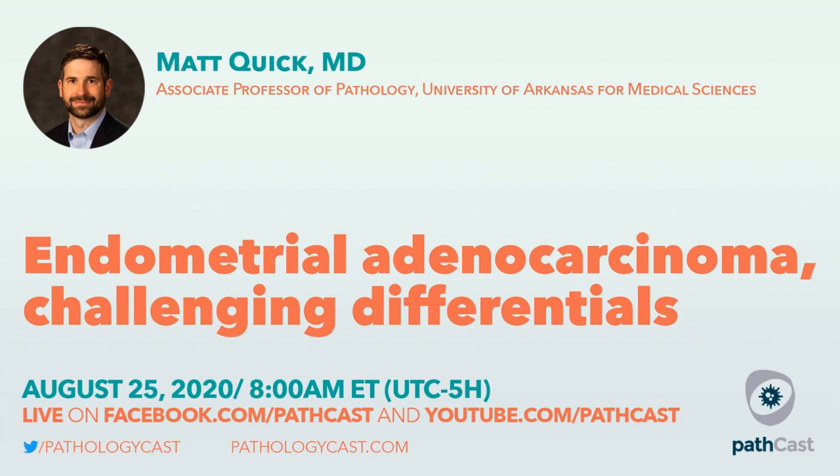Now, the thing that I haven't talked about and that I'm kind of dreading talking about is what we call the papillary proliferations of the endometrium. And there's been a couple of papers. Dr. Hart had a great article. Dr. Young had an article that talked about these papillary mucinous proliferations of the endometrium. And I bet this is what you're asking about.